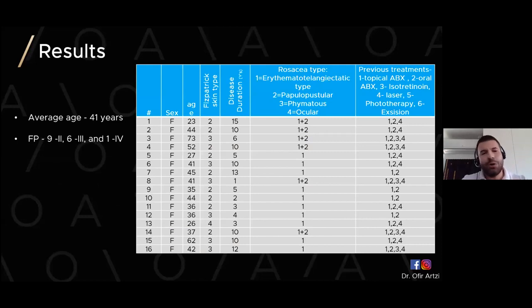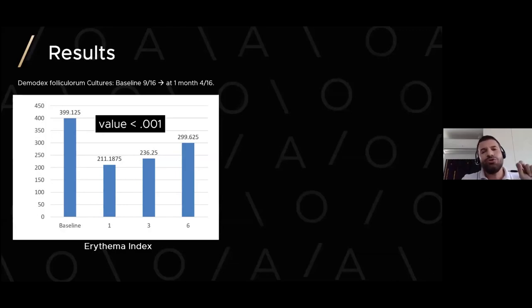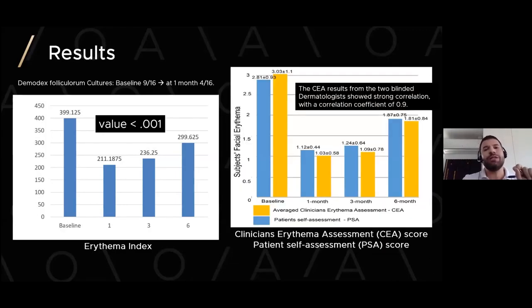So you can see, again, I will skip it because I'm sure you can read the publication, but I want you to look at the results, which I believe are very interesting. And nowadays we have more than 200 patients' experience. First, before and 1 month after treatment, there is a drop in Demodex folliculorum culture. Maybe it's the heat, and maybe this is part of the mechanism by which it works. But if we look at the redness, you can see the erythema index, and you can see the objective and the non-objective scoring systems.